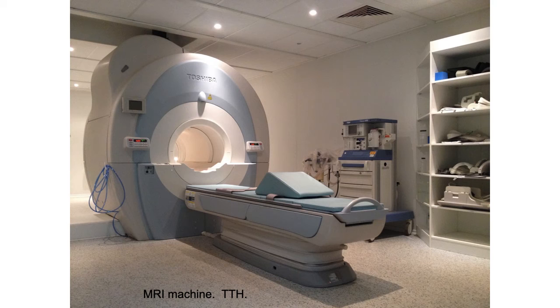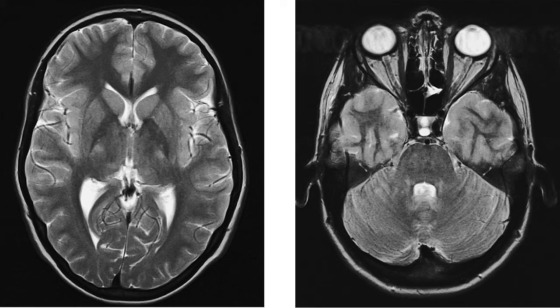So now these are examples of images from the MRI. Like I said, you don't have to go too deep, just know the terminology in the MRI. Like you can see here, the anatomical definition is supreme. So you have to know the anatomy very well.